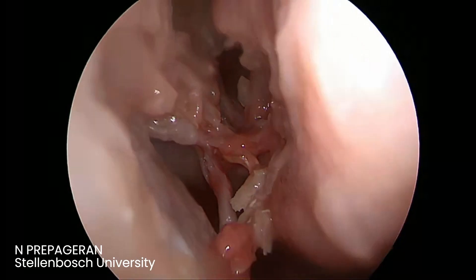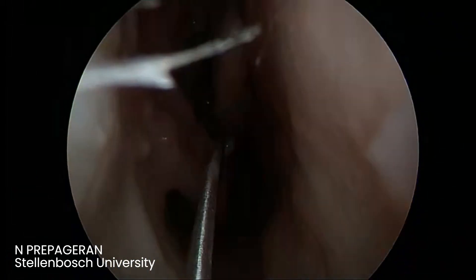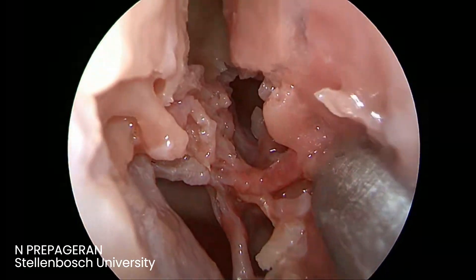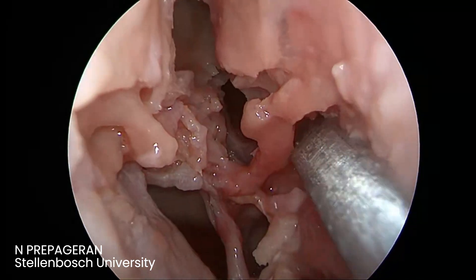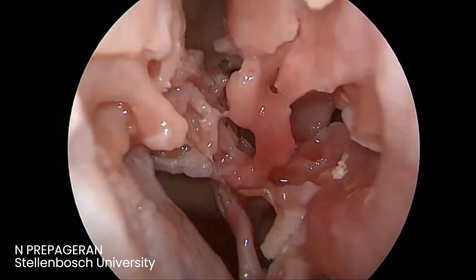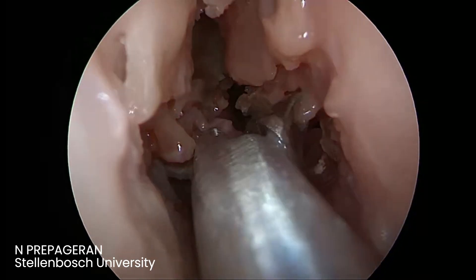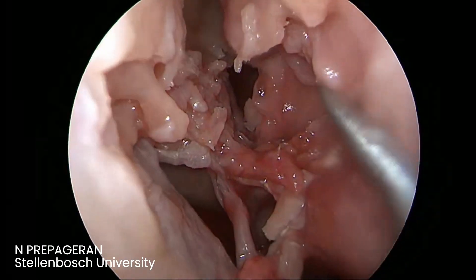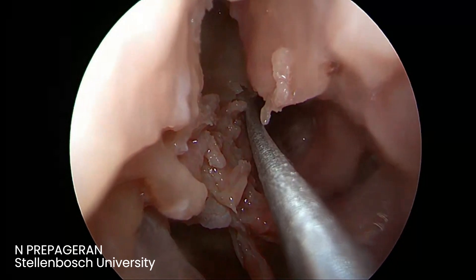So now we are in the posterior ethmoid. How do we confirm that we are in the posterior ethmoid? The easiest way to do that is to look for the superior turbinate. Repeat dissection here and you will be able to identify it. So the minute you see the superior turbinate here, know that it has to be the posterior ethmoid. The superior turbinate confirms our location.